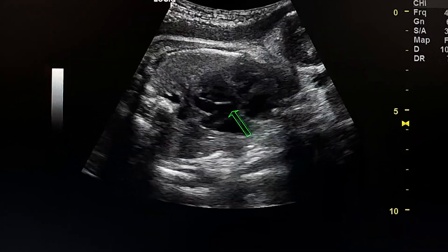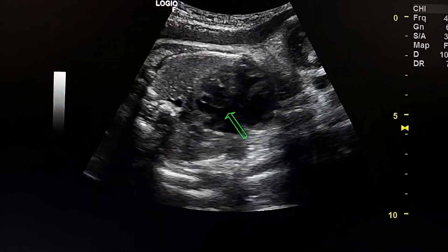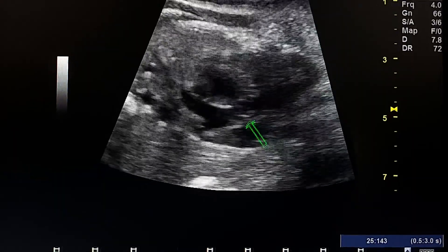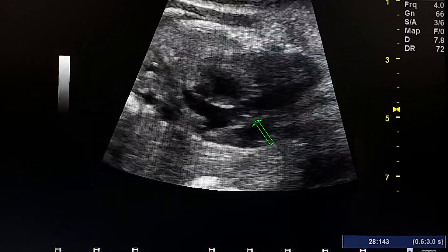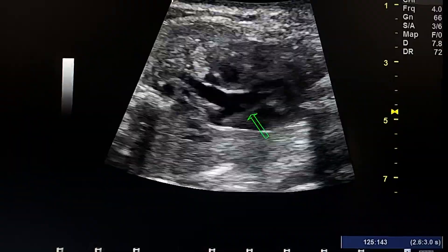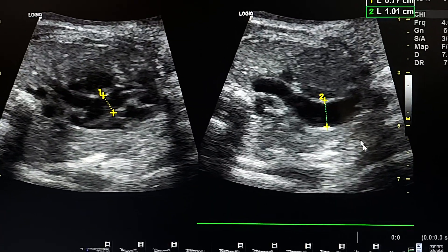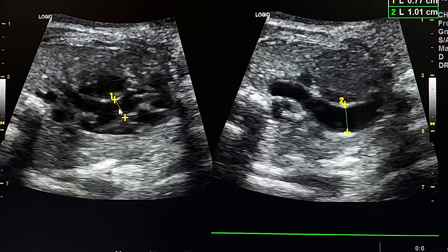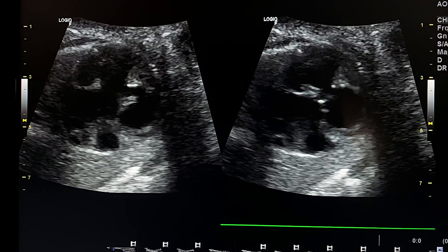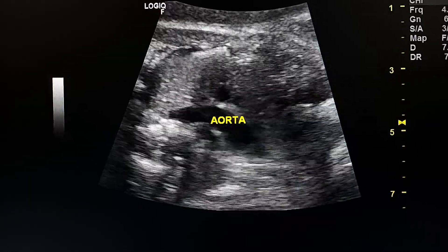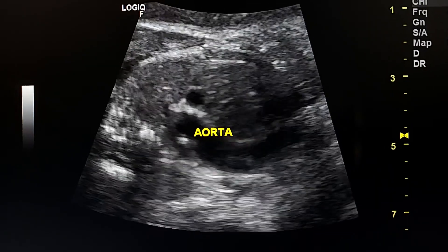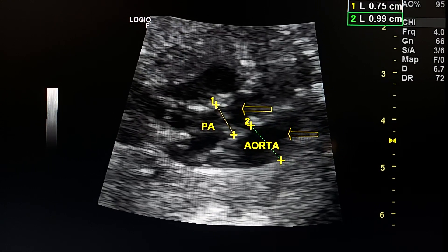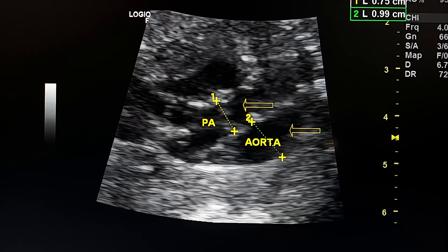In this view we see the pulmonary trunk on the left side, and this is the aorta. We see the two vessels arising from the heart in parallel. This is the aorta and this is the pulmonary artery. These are the two vessels in the three-vessel view.